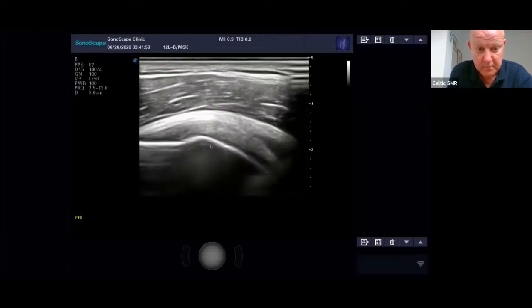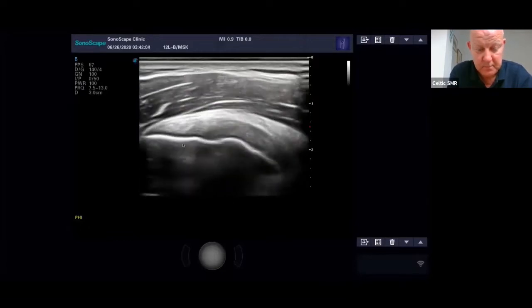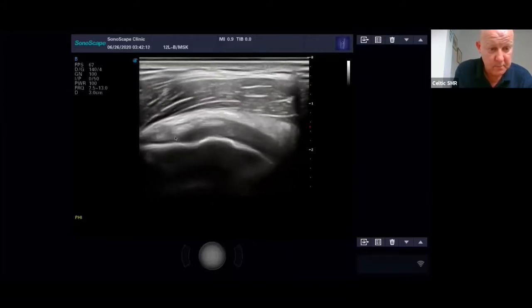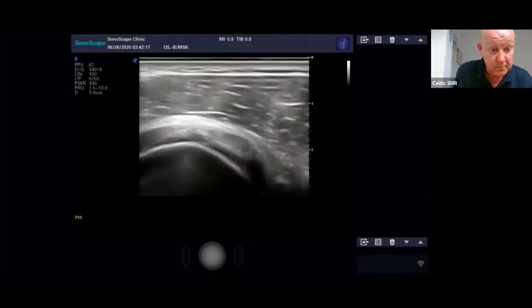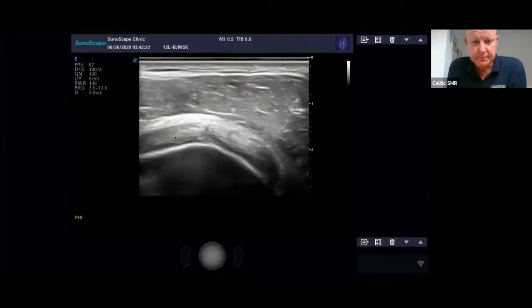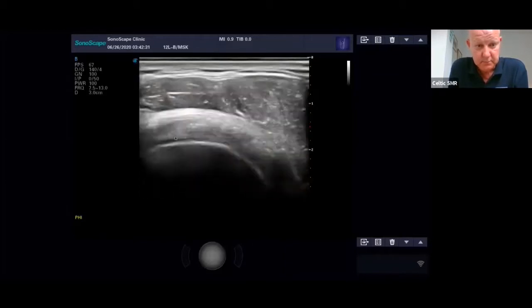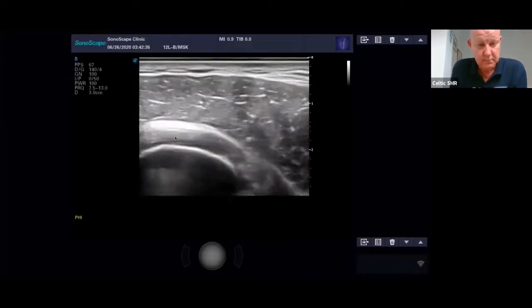Obviously look out for cortical irregularity, because I'm not sure what the exact figures are, but I think if you've got cortical irregularity, the probability of a tear is in the sort of 70%. If you've got fluid in the biceps tendon and also fluid in the bursa, then I think the figure goes up into the 90s. So they're all subtle things you can look for that can help you think, oh, I'm suspicious, I should be finding a tear.